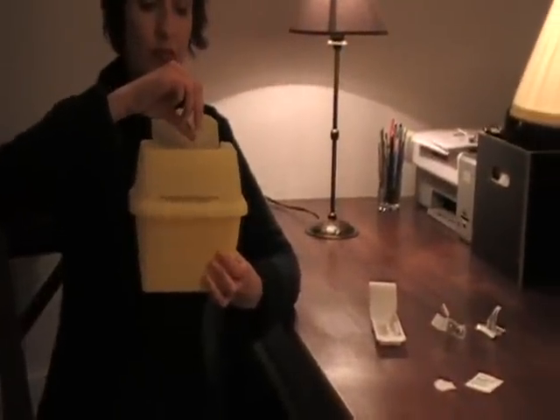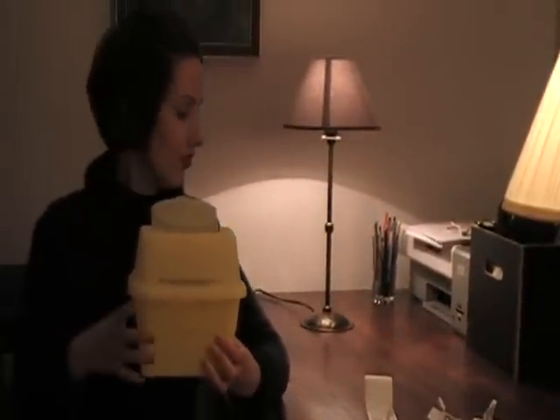Of course, as soon as you're done with the needle, you need to put it in your sharps bin. Et voilà. So as you can see, it's actually quite easy. There is an auto-injector pen, which I know nothing about because it's in my packet that came with Avonex and it's at work — I honestly haven't even looked at it. I'm very lazy and couldn't be bothered with the auto-injector, but if you want to do that, that's another option.